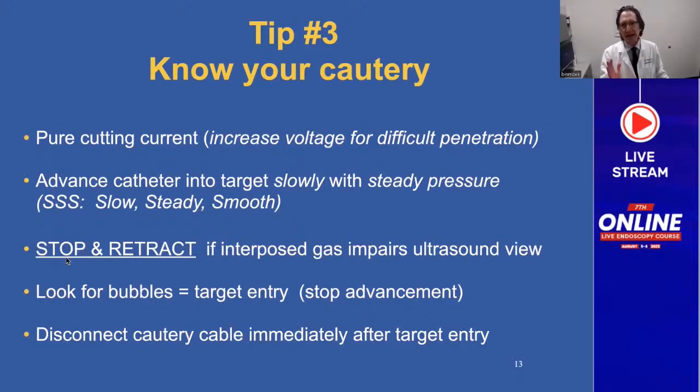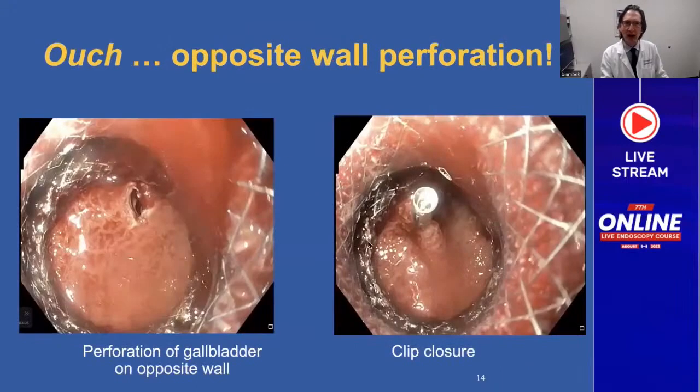Stop and retract if interposed gas impairs your ultrasound view. If you're getting any gas and can't see your target, stop and retract a little bit until you get your view again. Look for bubbles — you'll see bubbles from the heating of fluid as soon as you enter your target. At that moment, stop your advancement so you don't go through the opposite wall, and disconnect the cautery cable immediately after you enter your target. Here's an example: I perforated the opposite wall of the gallbladder because I didn't stop in time, but fortunately I was able to close the hole with a single clip.